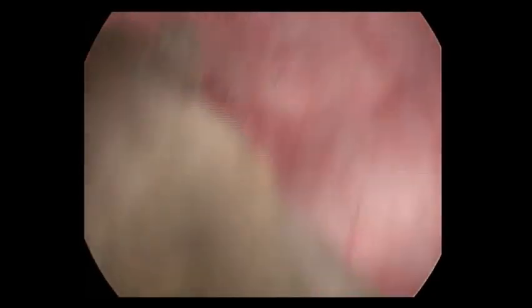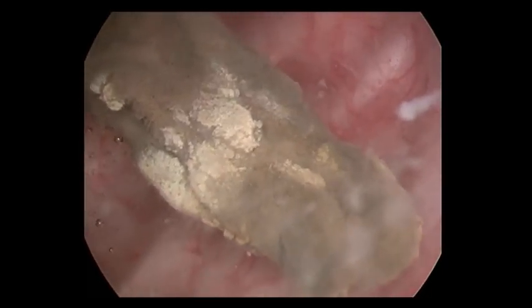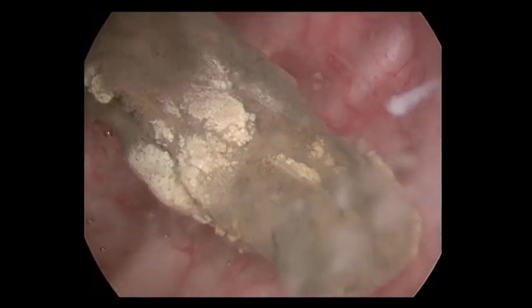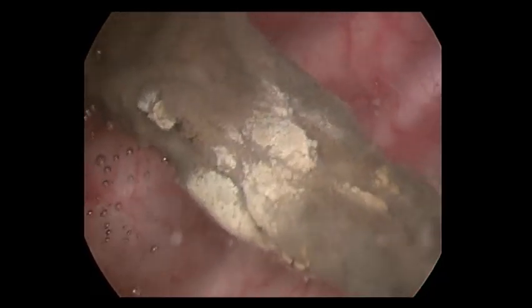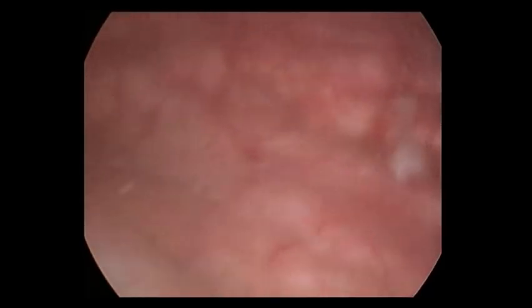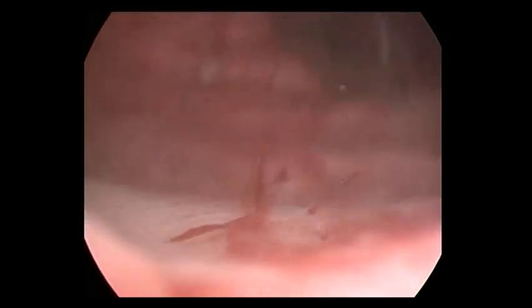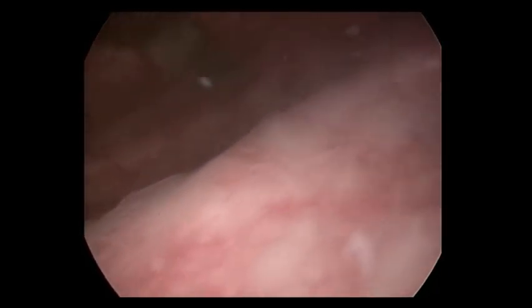The tubular bladder calculus with secondary deposition is visible. There are trabeculations present. This is the right ureterovesical opening, the trigonal ridge, and the left ureterovesical opening.